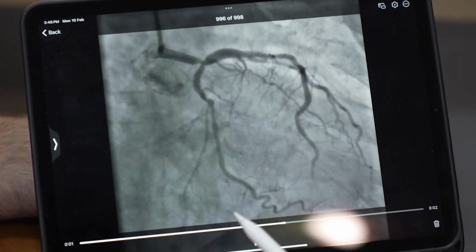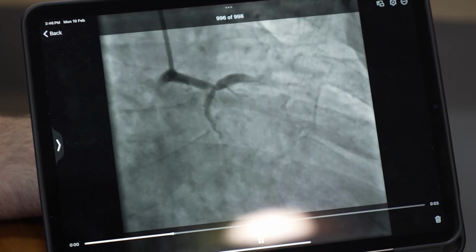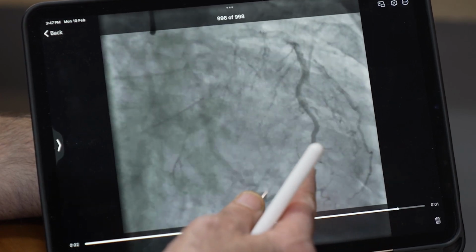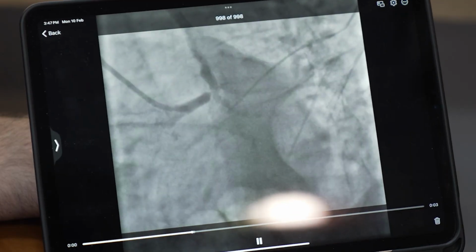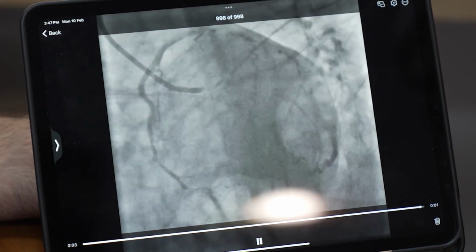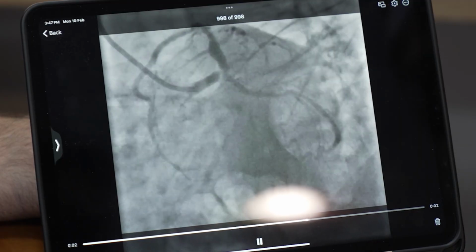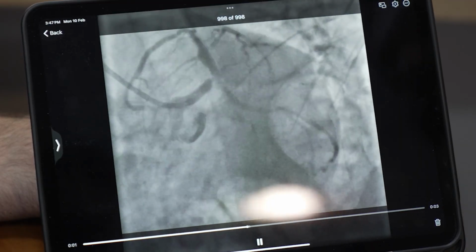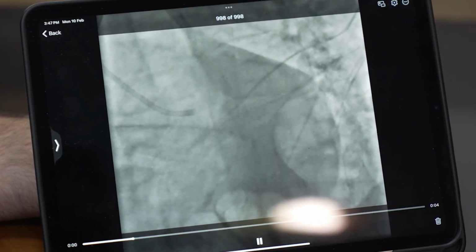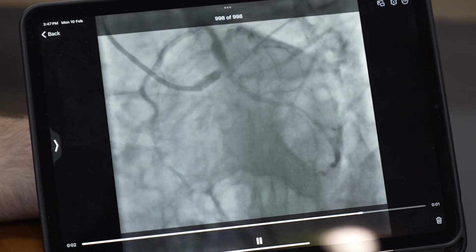After preparation of the lesion, now we come to stenting. What technique are you going to use for this left main stem bifurcation? For this bifurcation, we have two options. Firstly, provisional stenting. After stenting the left main to LAD, we will see the ostia of the circ. If not jeopardized, we will go with provisional stenting. If the ostia is jeopardized, we can go for T stenting, I think.